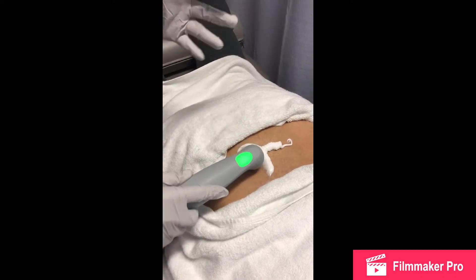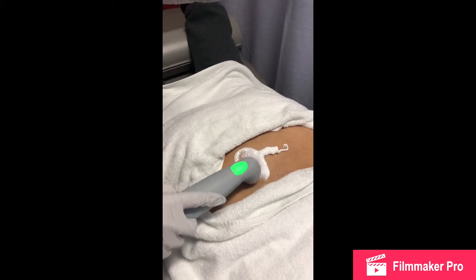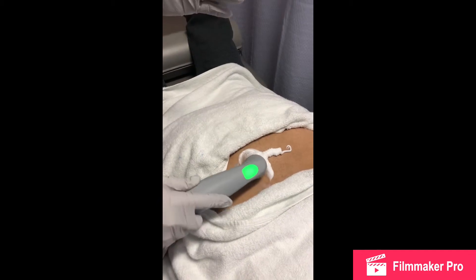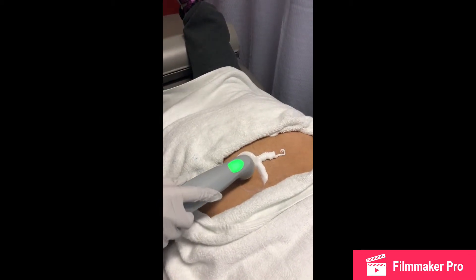Our weight does fall between L5 and S1, and that is where she does have most of the degeneration in that area.